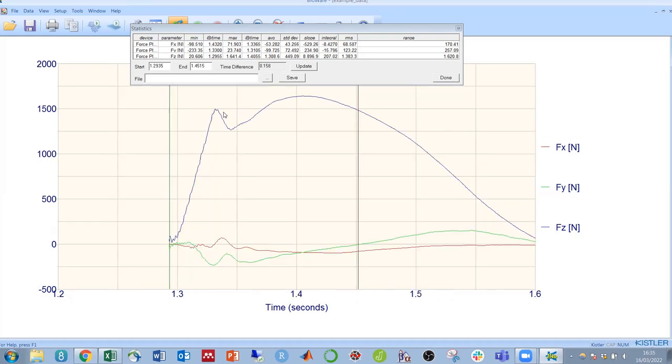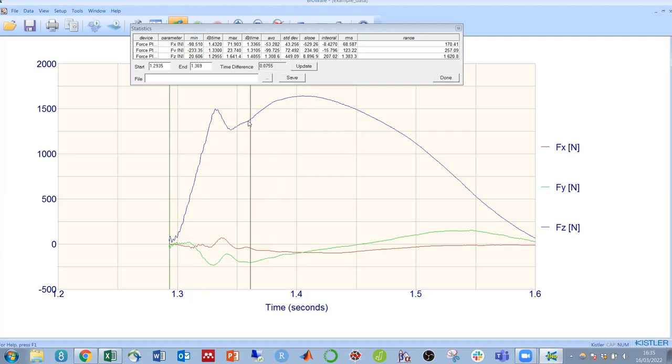If we wanted only this first impact peak of the ground reaction force, you could move the end point over here and extract just that peak.